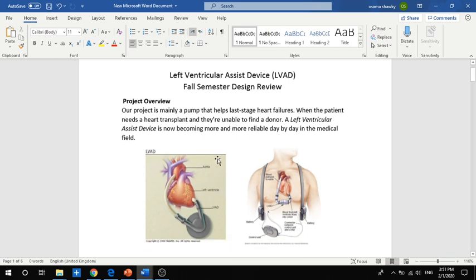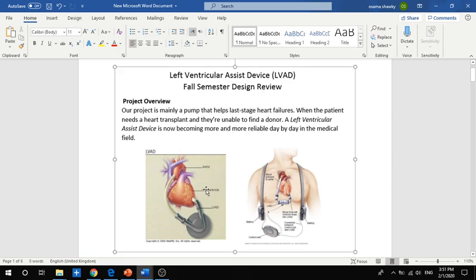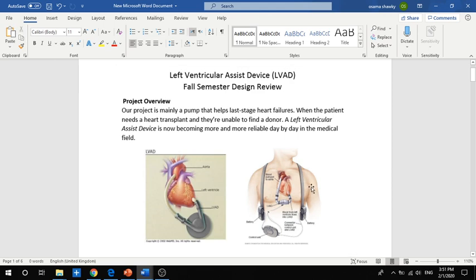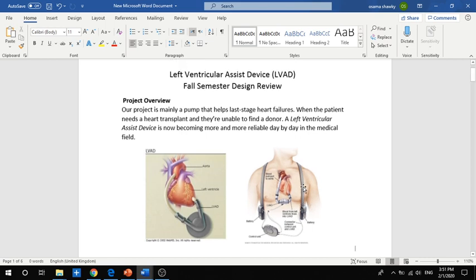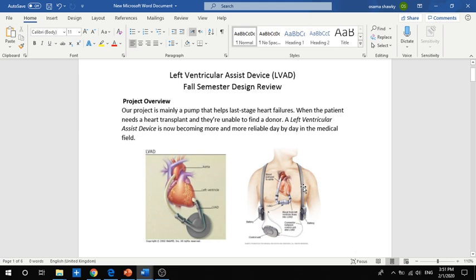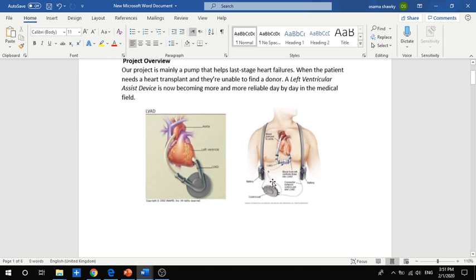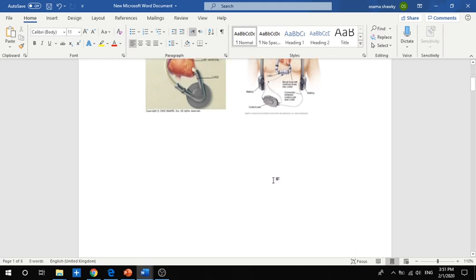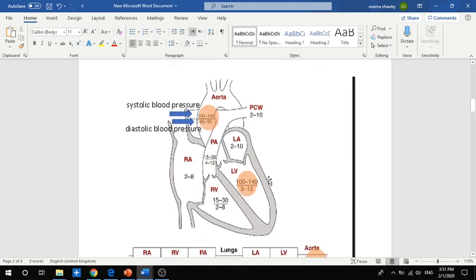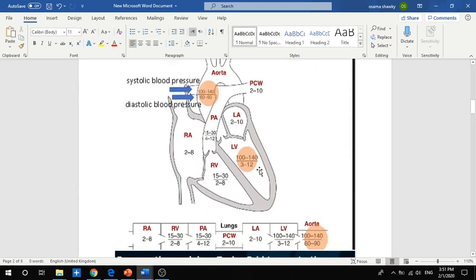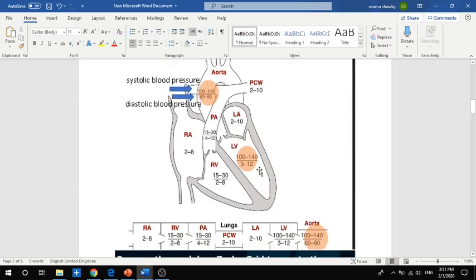As we've talked about, this is a project about a left ventricular assist device, which is basically a pump. I'm going to show you how to design a pump from scratch and how to simulate it in simulation software. From an engineering perspective, we have the left ventricle assist device taken from the left ventricle to support blood flow in the heart.